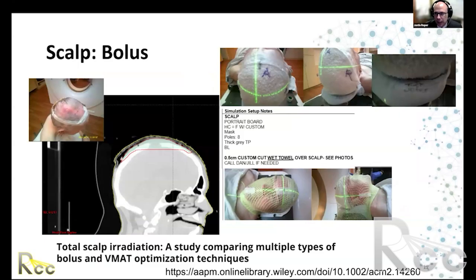Scalp patients are another type of head and neck treatment in which the treatment setup can be quite challenging. In particular, it becomes quite challenging when the extent of the disease expands over a large concave area, such that a single en face electron field is no longer adequate. And in this case, we're going to consider multiple photon fields or arcs that come in tangentially to hit the scalp, that is the disease, while at the same time avoiding the brain, which is often in between, right?